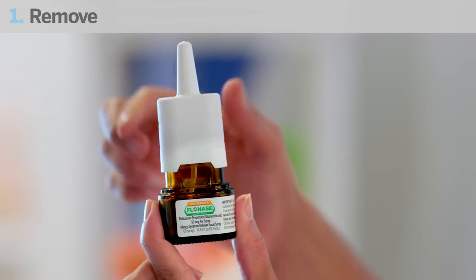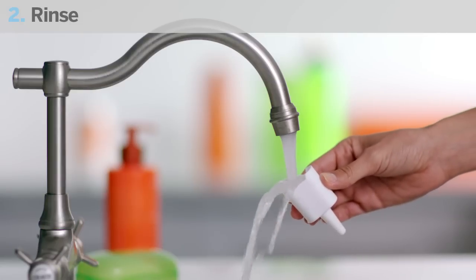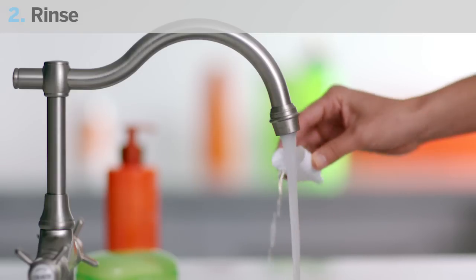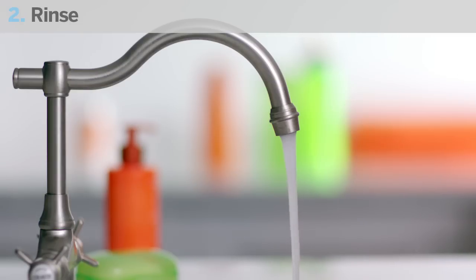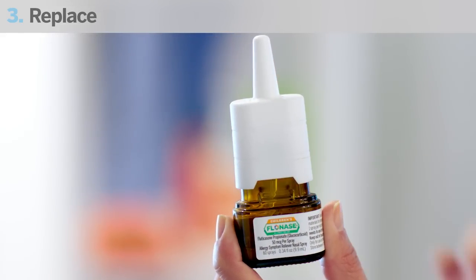To clean the spray nozzle, first remove it by grasping the base and pulling up. Next, rinse the nozzle under a running tap and dry it at room temperature. Once it's dry, aim the nozzle away from your face and gently replace the spray nozzle until you hear a soft click.